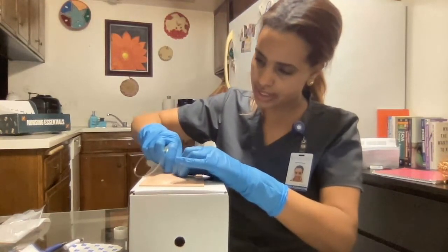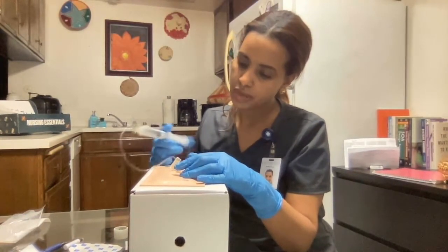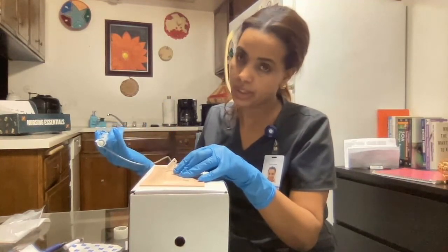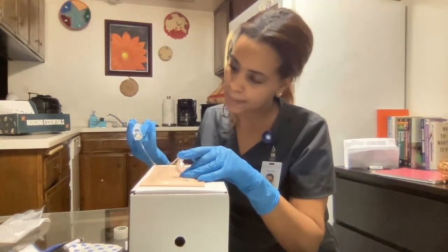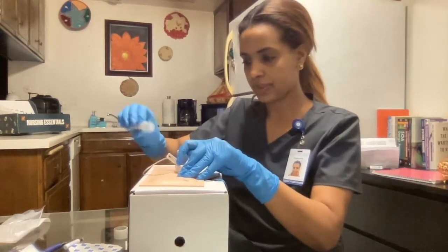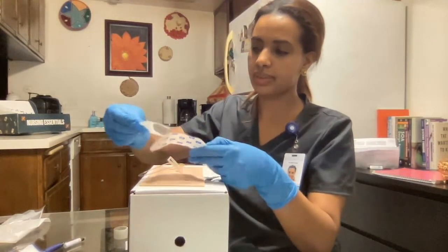After applying the tourniquet, I'm going to check for the presence of a distal pulse — I feel the pulse. After that, I'm going to grab my solution and clean using a friction back-and-forth motion for about 30 seconds. After cleaning, I will let it dry completely. Then I'm going to place my thumb to anchor the vein, four to five centimeters distal to the site, and stretch the skin against the direction of insertion.